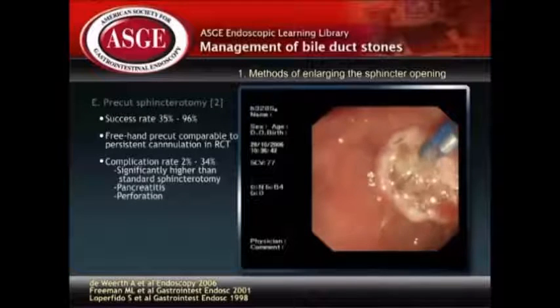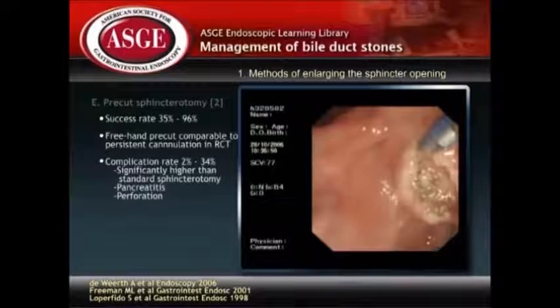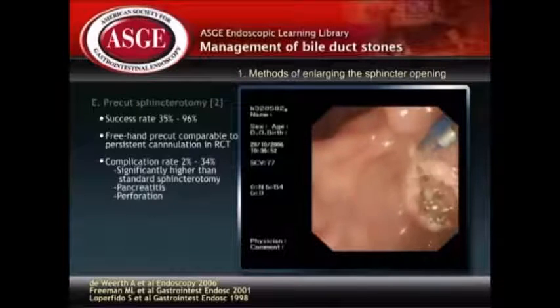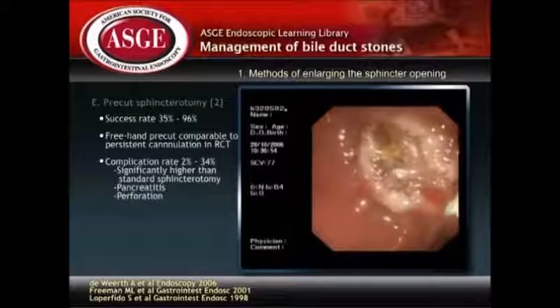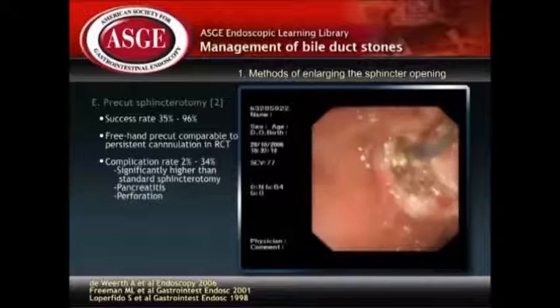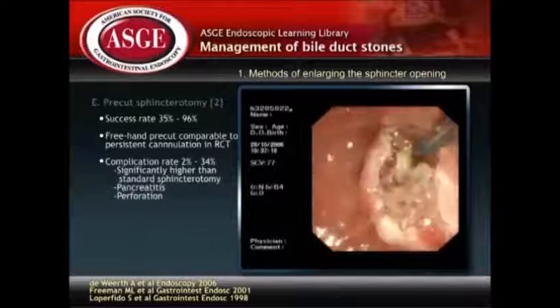After the common bile duct channel was opened, bile was seen coming out from the orifice and cannulation of the CBD can then be performed.